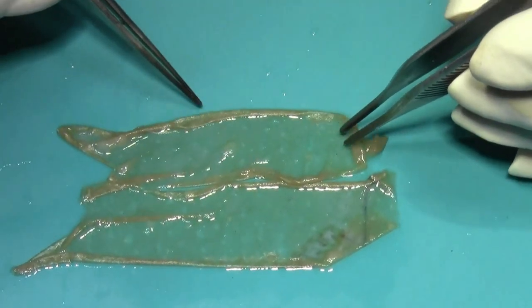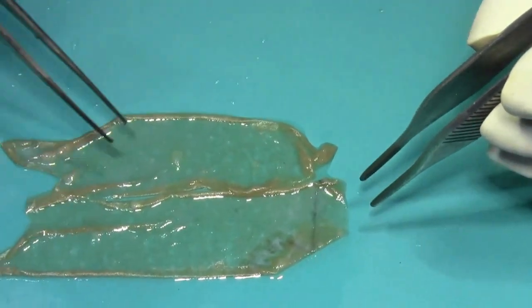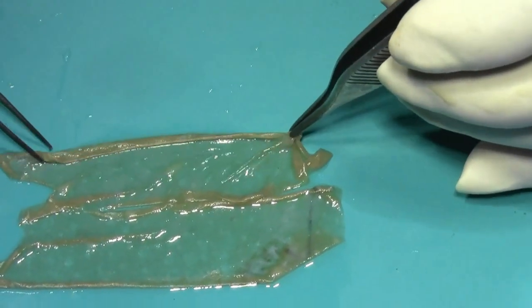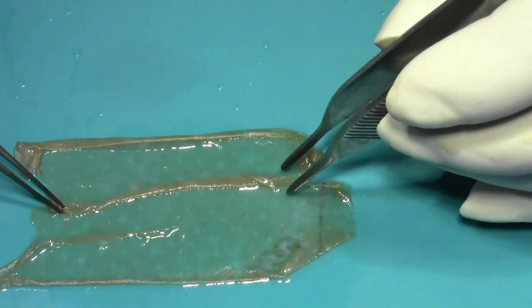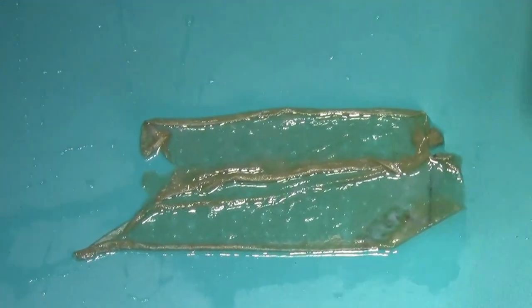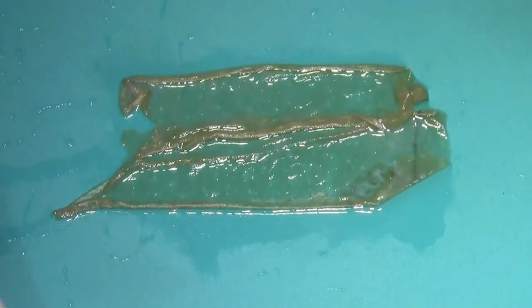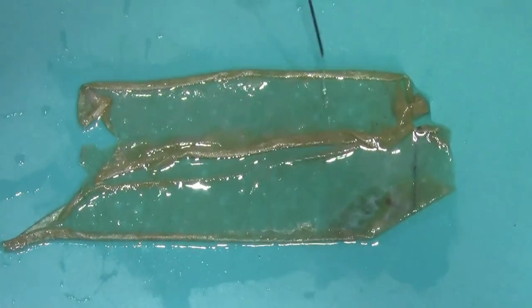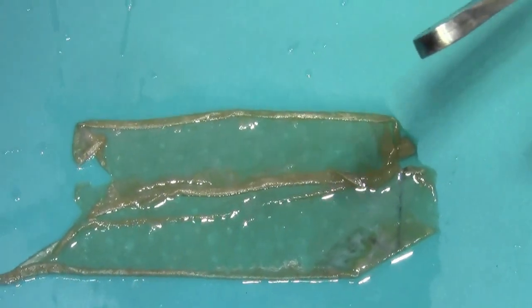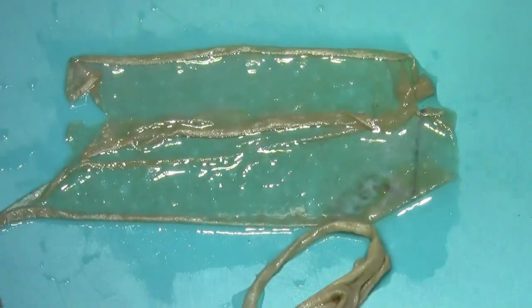These two strips are from our dermatome. You can notice there is hardly any dermis — this is an ultrathin graft taken by the dermatome. It is very fine, with hardly any dermis at all.